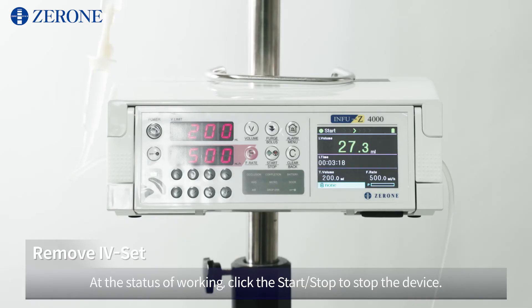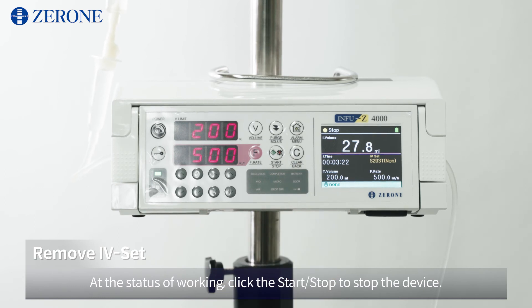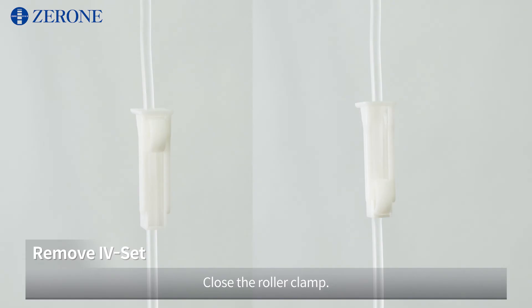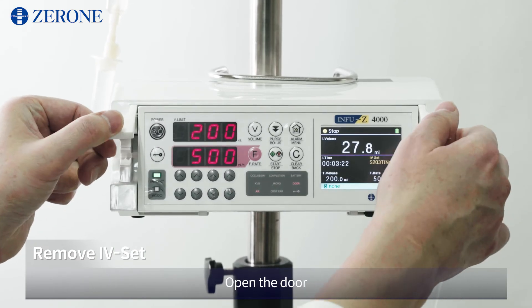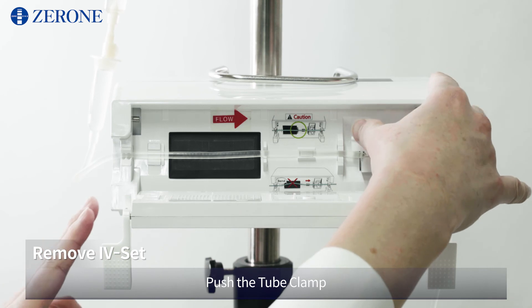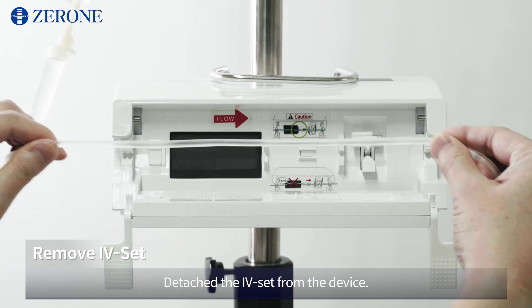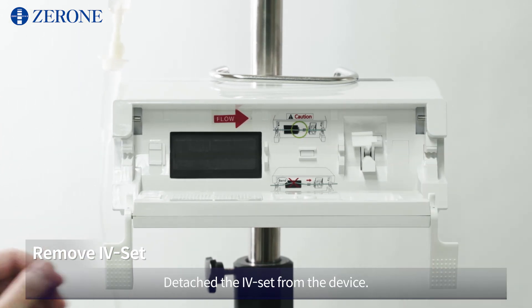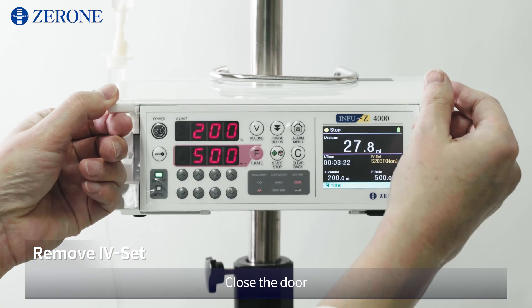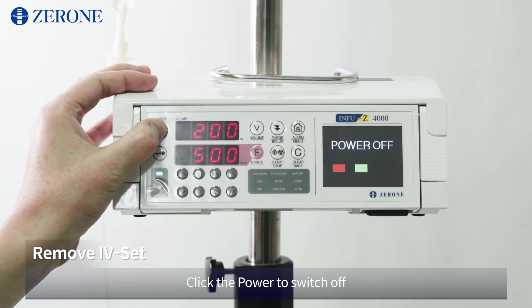At the status of working, click start/stop to stop the device. Close the roller clamp. Open the door. Push the tube clamp and detach the IV set from the device. Close the door. Click the power to switch off.